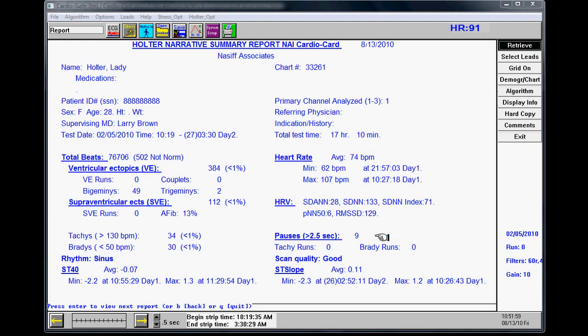At this time, you want to write down the number of pauses and PVCs that you have. Too many pauses could be an indication of a poor hookup. On your keyboard, hit Q for quit and go back to the main screen.